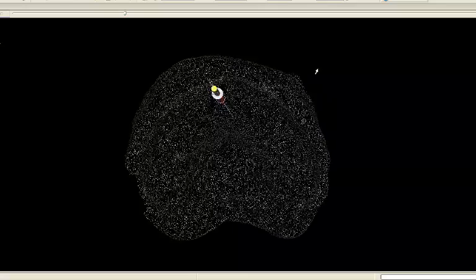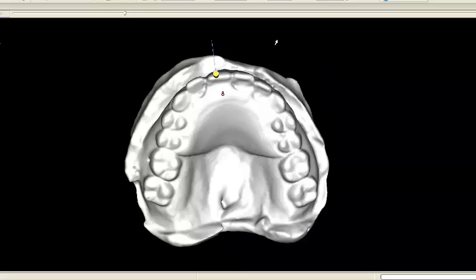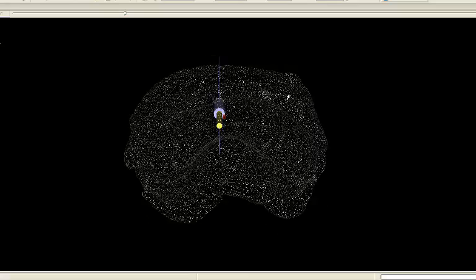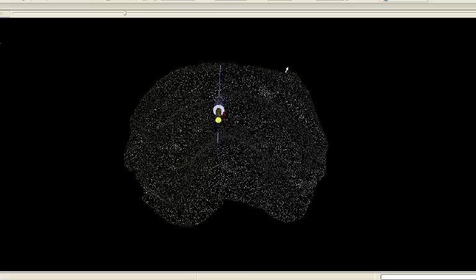And in the final example, a simple flipper is used to determine future tooth position.